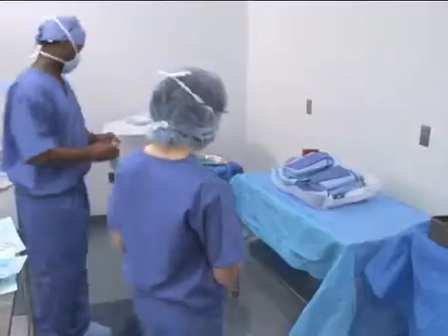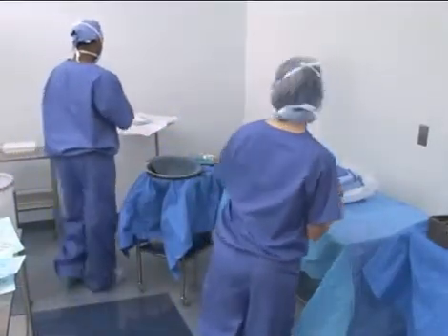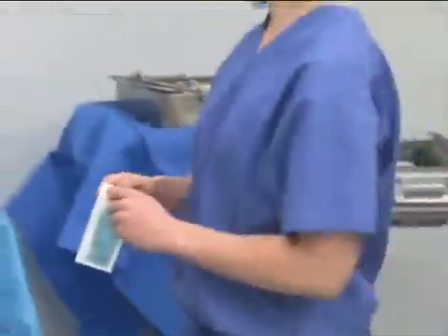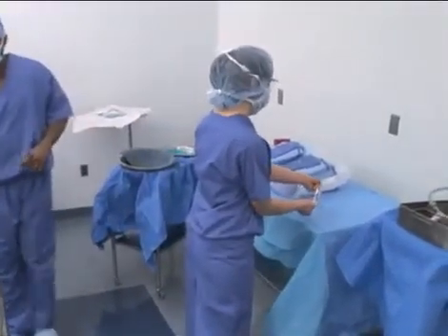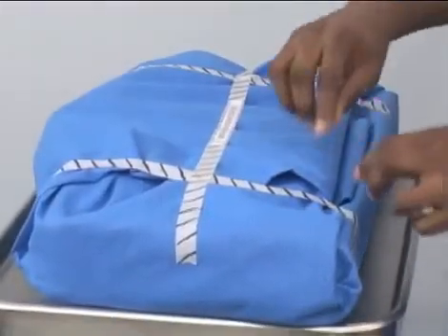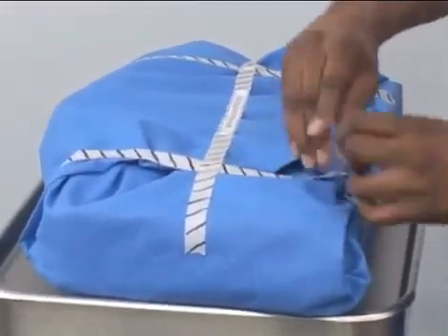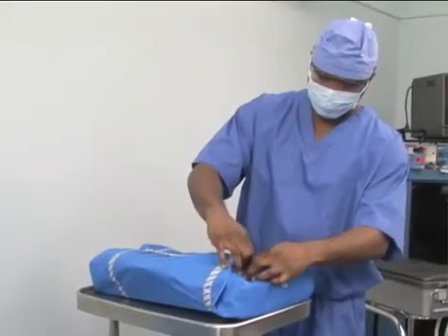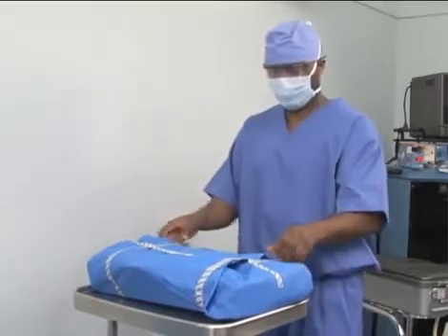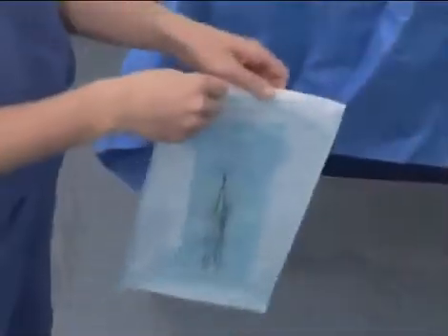Some tips to remember when opening a case. Always maintain a safe distance from the sterile surface to avoid contaminating them, but stand close enough to accurately distribute the item you are opening to the sterile field. When opening packages wrapped in non-woven or paper wrappers sealed with tape, break the tape rather than tearing it. This prevents the outer wrapper from ripping and causing contamination.